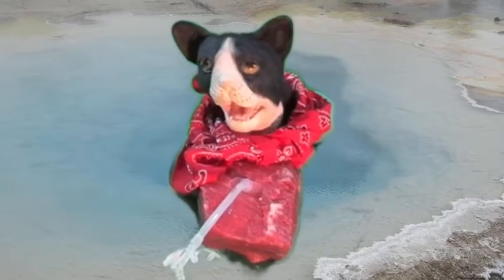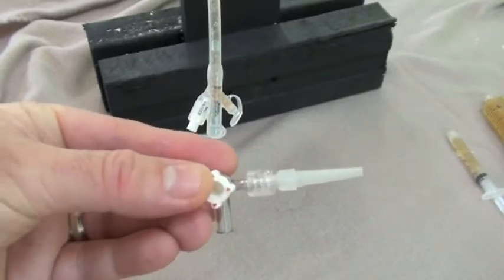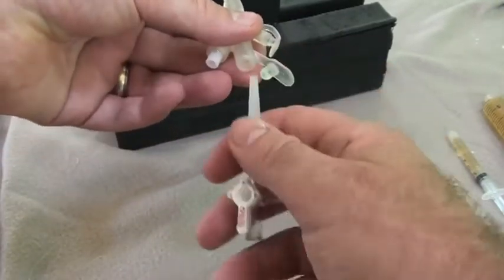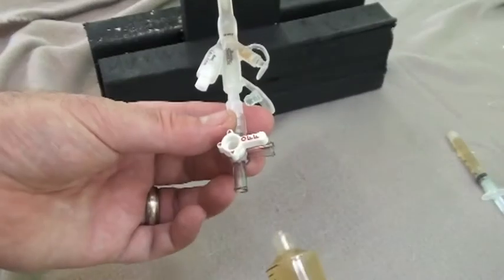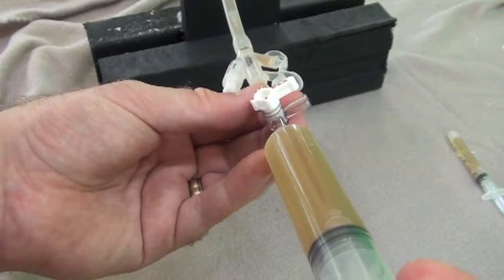What else you got? You can take a three-way stopcock and what we call a Christmas tree adapter. This is something that your respiratory technicians should easily be able to get for you. And you screw the Christmas tree adapter into the three-way stopcock and put it into the feeding tube. Then, through one of the ports in the three-way stopcock, you add as much of your carbonated beverage or whatever you're going to use as you can. Then you lock that port on the stopcock.